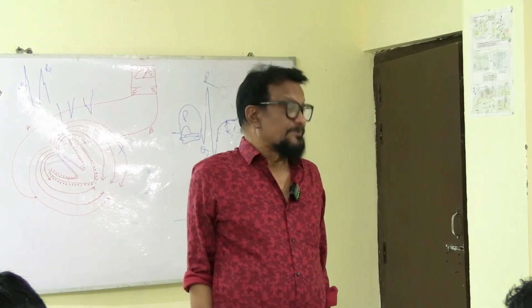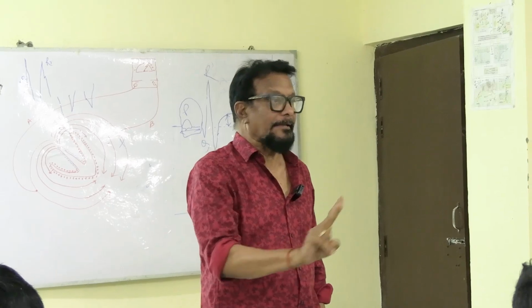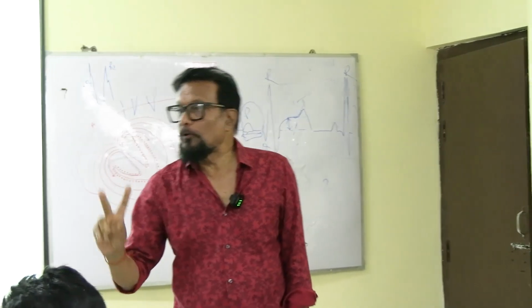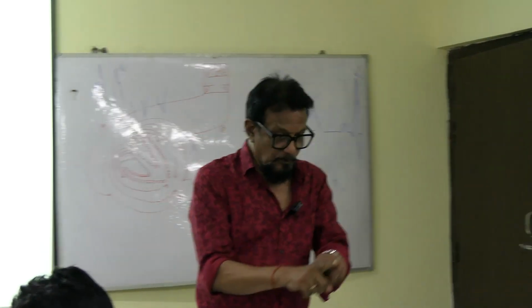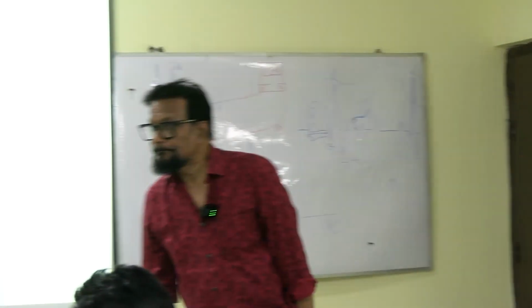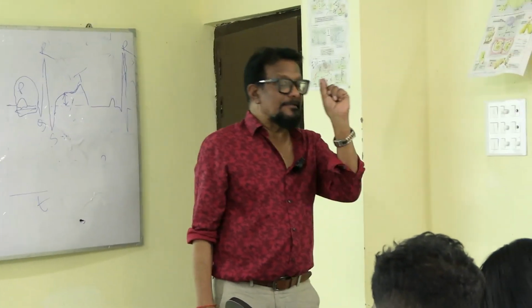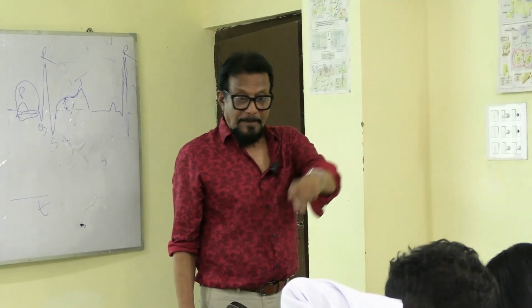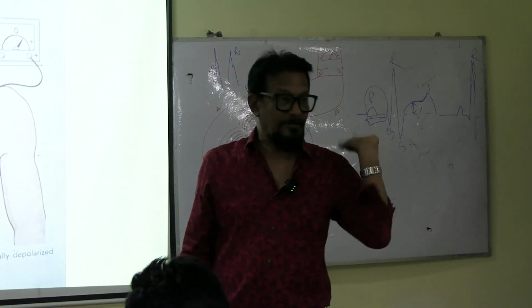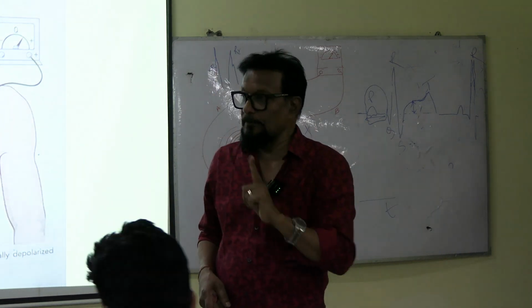We use different lead systems to record ECG. Two types. Remember this, every day I cannot discuss it. One is unipolar, another is bipolar. Unipolar, bipolar. Now, bipolar leads are of three types: Lead 1, Lead 2, Lead 3.